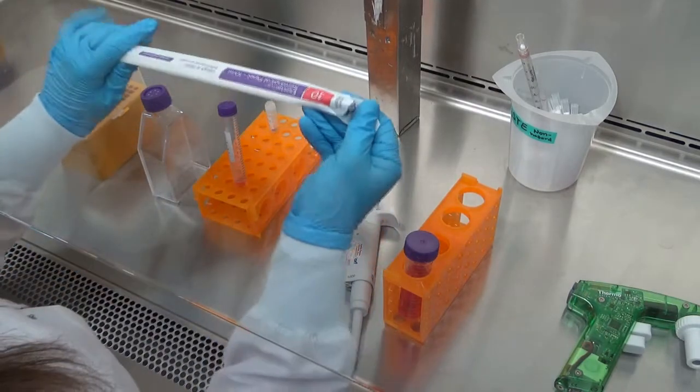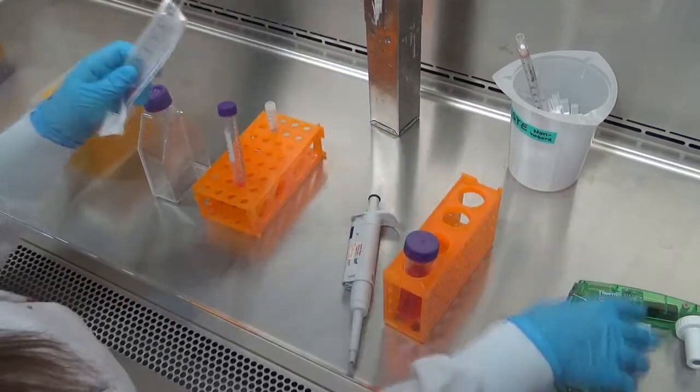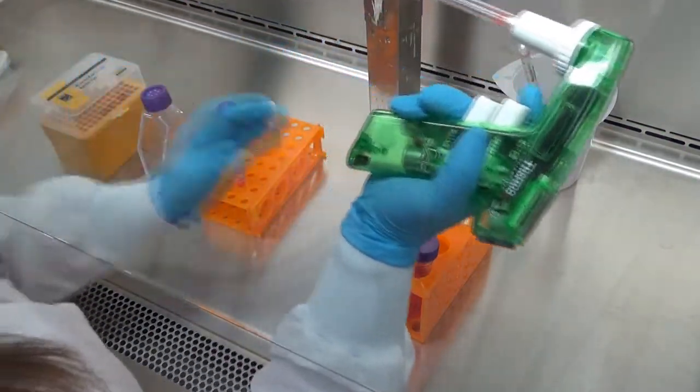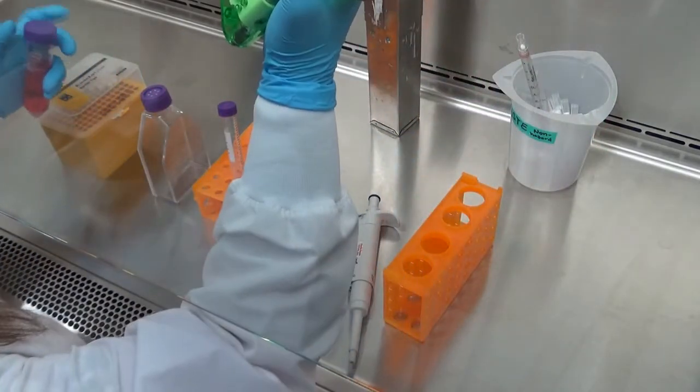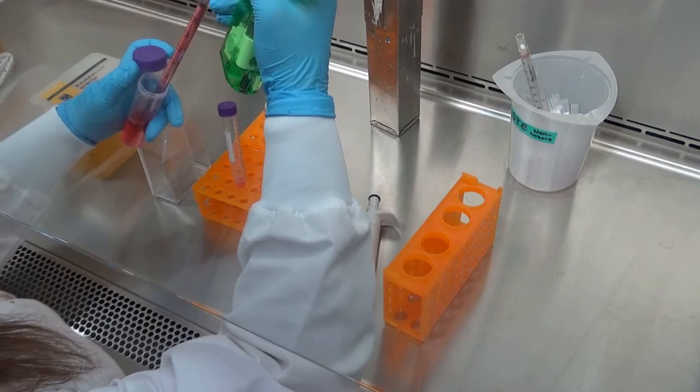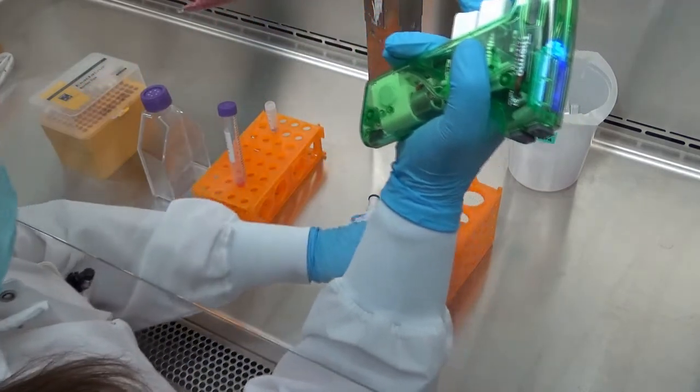At this point, you can add media up to 5 ml to perform a cell count as shown in part 3 of this series. Alternatively, if you know the number of cells that was originally frozen, you can resuspend the pellet in a specific volume to achieve a desired concentration for seeding.